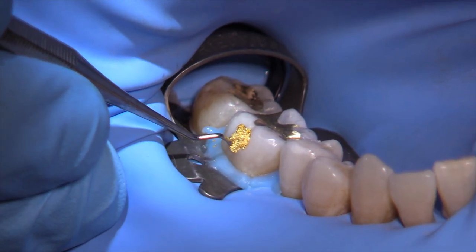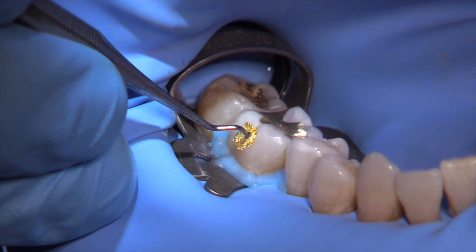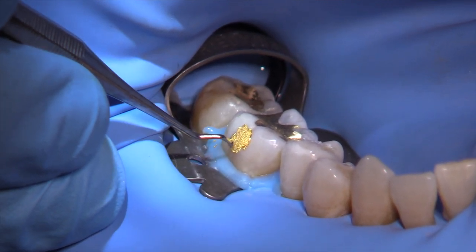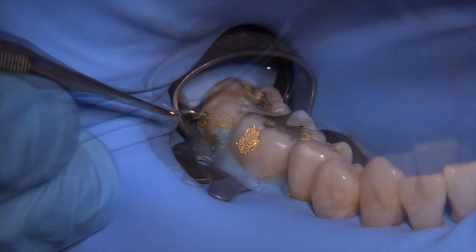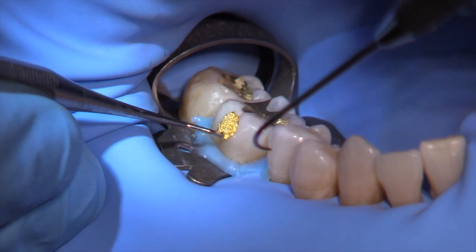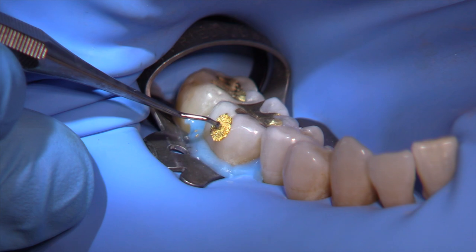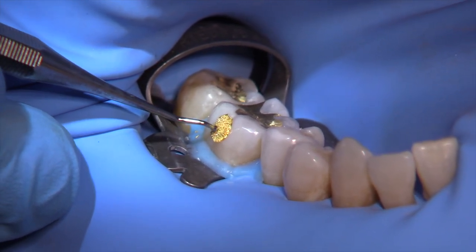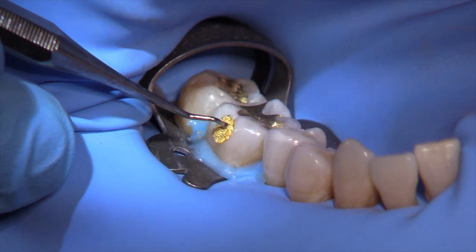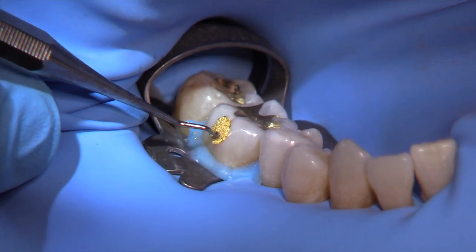We're coming to the very end — we're starting to add gold directly in the middle, working across in little half-millimeter steps. It's very common to overfill the gold foil to make sure you've sealed all the margins, and that's okay, but it requires a little more cleanup. When we have enamel margins, excess gold is easy to remove without worry. However, for a Class V gold foil on dentin, we like to remove the foil as we go because we don't want to use a rotary instrument on dentin — you could damage it very easily.